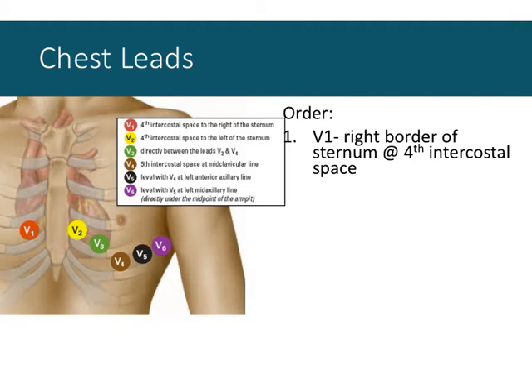So they're like the augmented voltage. We generate a signal from only one electrode, and it projects directly back through the heart. So they're a special electrode, the mechanics of which that make it work I'm not exactly sure, but one electrode generates a signal pointing directly back through the body. And you'll practice placing these when we get to lab, I think it's next week.